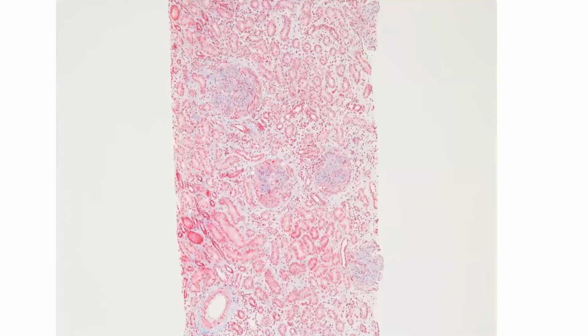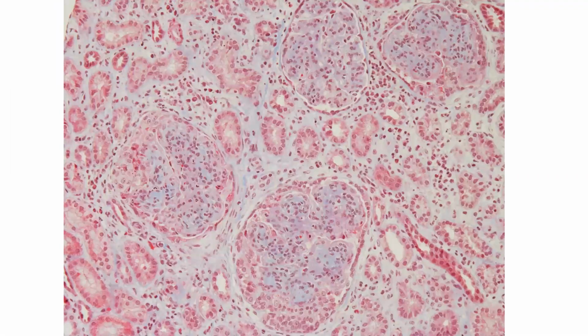Yeah, so this is her biopsy performed in 2017. At low magnification, you can see that there is diffuse interstitial inflammation and interstitial edema. There's a very pale quality to the staining of the interstitium. Even at this magnification, you can see there's something going on with the glomeruli. Looking more closely, all the glomeruli were diffusely involved by a similar process. They're hypercellular, very solid and lobular looking, and you get a sense of florid endocapillary hypercellularity within these glomeruli. You also begin to wonder if there's too many cells in Bowman's capsule in this one and this one.